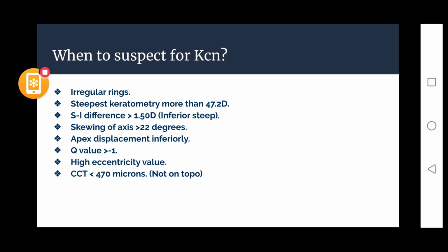This could be a subclinical stage of keratoconus, which right now may not appear on the corneal topographer, but it can appear on your retinoscopy, while taking the history of the patient, a family history, as well as it might appear on Pentacam, that is the corneal tomography, or OPD-Scan and so on. I hope everyone is following about when to suspect a keratoconus.